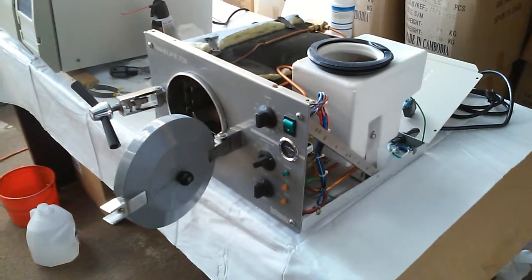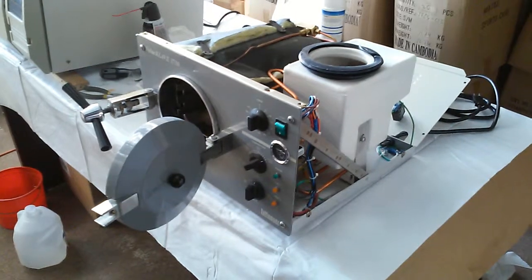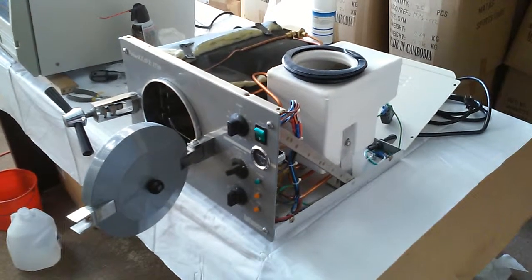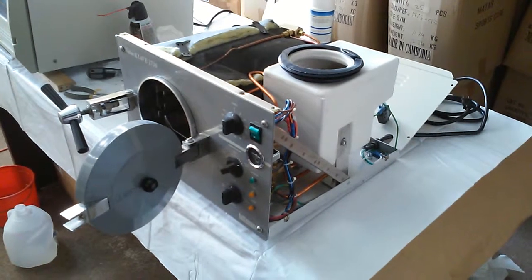This video will show you how to repair Tuttnauer M-type sterilizers. These are manual, not automatic machines. Most two-nut M-type sterilizers are the same on the inside — the main difference is only the chamber size.